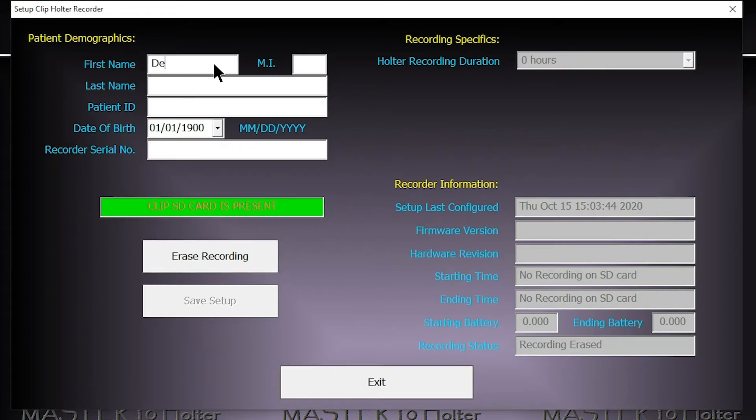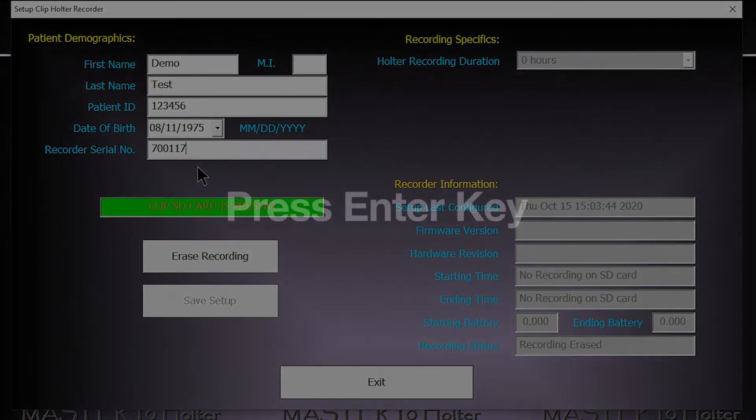Enter all patient data including the appropriate serial number of the clip device that you are planning to use for that patient. When the patient data is filled in, press the enter key on the keyboard and then click save setup.